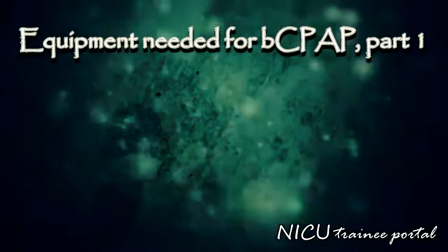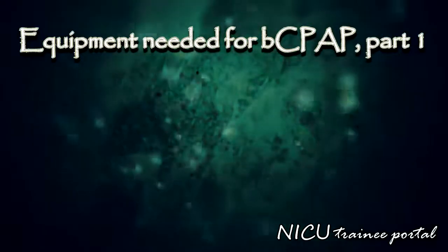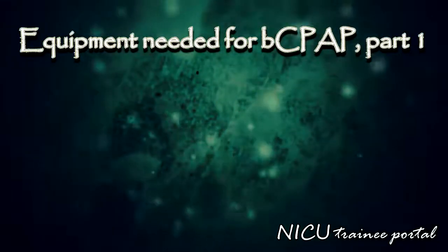The following section outlines the equipment currently being used at one of our NICUs to set up bubble CPAP in a patient. You should follow your own institution's guidelines.